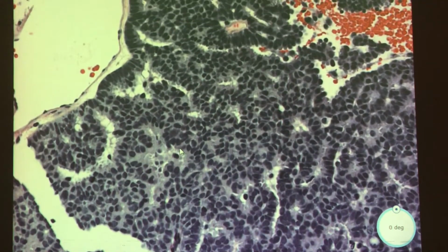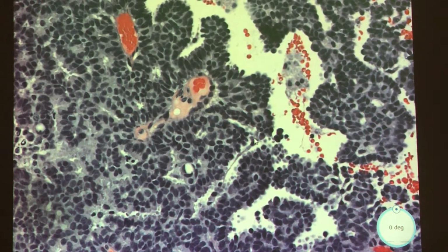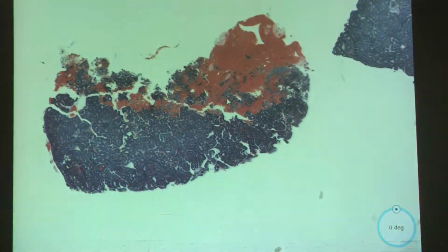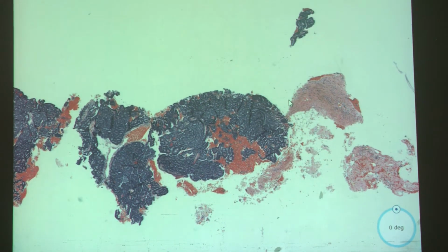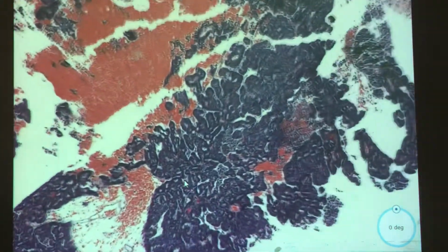Going back, evaluating if there's pleomorphism, increased mitotic activity. On this projection, it's a little hard to see nuclear features, but there does seem to be some cells that stand out a bit more, that are a bit larger than others. So I would say, on the whole, even though they look similar, I'm assuming this is another DCIS case. It's hard to tell because the pieces are kind of small; you will probably sign this out as cannot rule out invasion. Yeah, you'd hedge on these. But let's assume this is DCIS. I would say this is probably an intermediate grade DCIS.